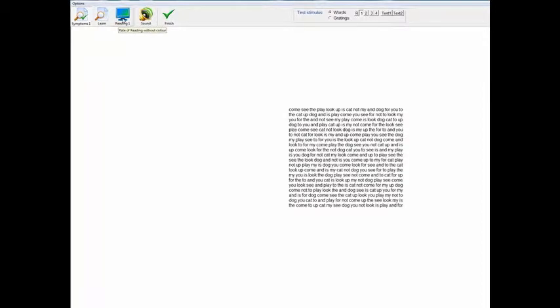We then go on to the rate of reading test. Here you simply start the clock at the bottom left and ask the patient to read the words as quickly and as accurately as possible. Every time they make a mistake, you click on the plus sign or press the space bar — it has the same effect and just increments the counter. As the patient starts reading down through the text, if they suffer from Meares-Irlen syndrome, it will become uncomfortable. The words may appear to move, wobble and flicker. They'll make more mistakes and their fluency will be affected by the symptoms.